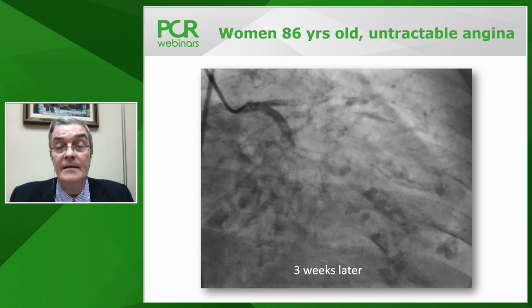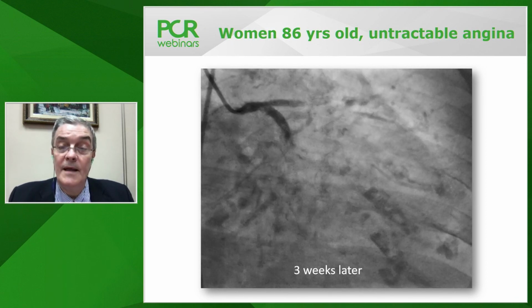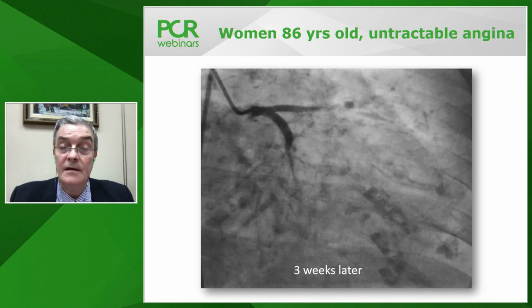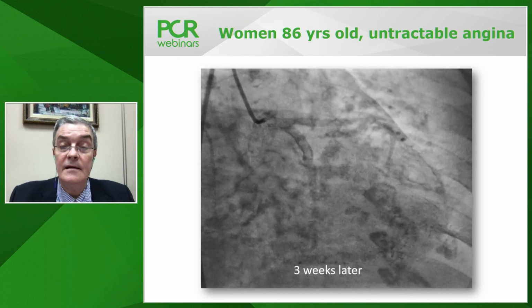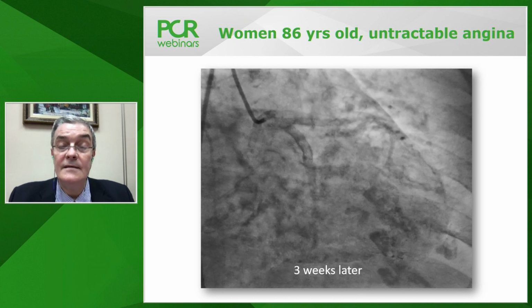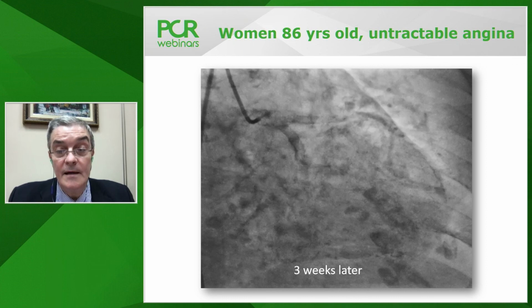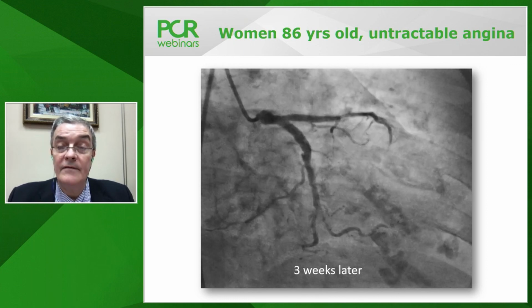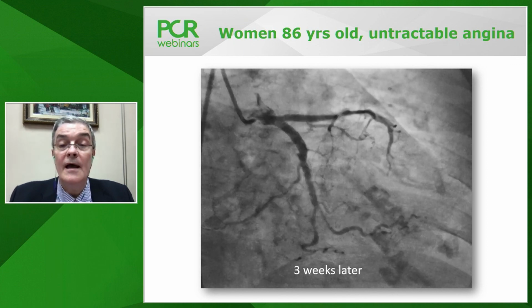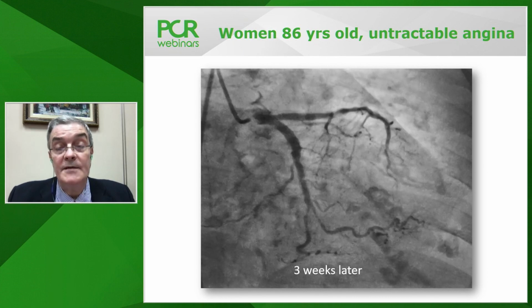And at least in my practice, if I can start, I try to understand the anatomy, plaque distribution, importance of lesion preparation. Imaging may help. Still, in the majority of left main cases, not in an acute or unstable case like this one, but in the majority of elective cases, we really recommend image-guided left main PCI. I think people can only benefit from the use of imaging. And then the selection of strategy is based on your personal experience.